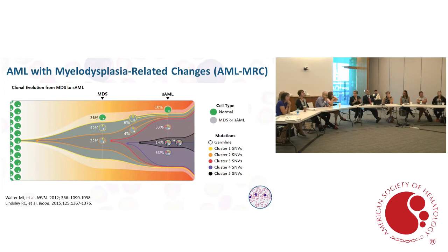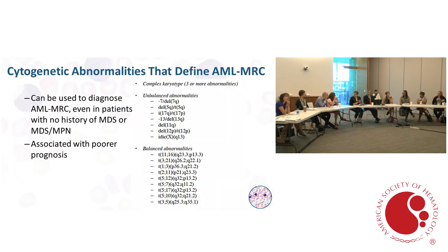All right, so you're only as good as the material that is presented to you. The material should be sent rapidly to the laboratory. We use a transport medium that contains our tissue culture medium along with some heparin, and it's got a fair amount of serum in it to keep the cells happy, because these cells are growing unstimulated. So it's whatever the innate ability of those cells to divide is. That's why your labs are always asking you for the sample quickly. Don't refrigerate it. You don't want to slow it down in any way. They're put into culture for either 24 or 48 hours. And we can do some things to introduce some synchronization to try to get some better looking chromosomes as well.